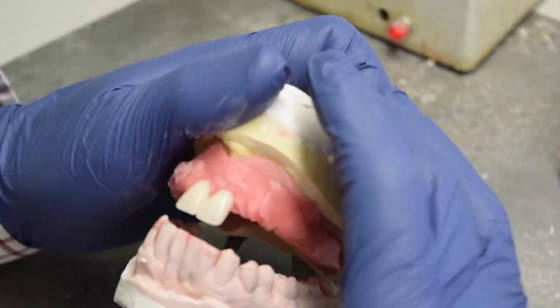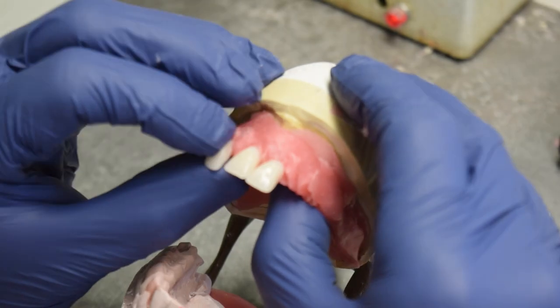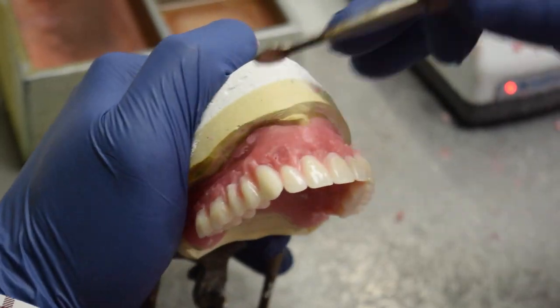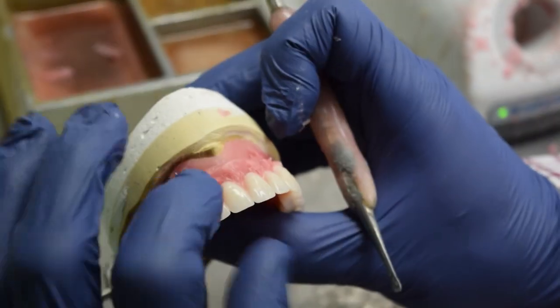Our lab techs rely on decades of experience to ensure the shape and thickness of the denture is made for optimal performance. Once the teeth are added, the denture is handed over so the waxed base can be shaped and molded to better resemble your natural mouth.